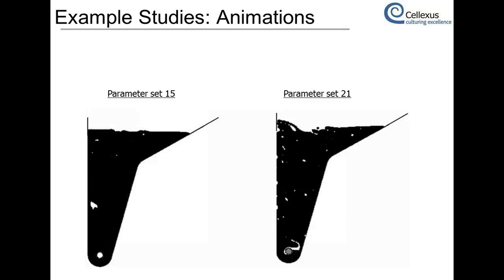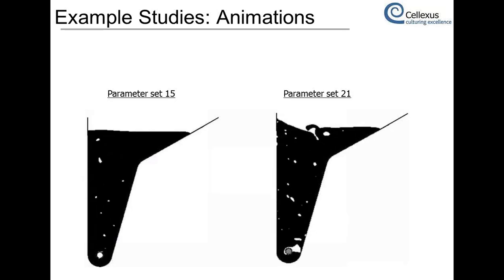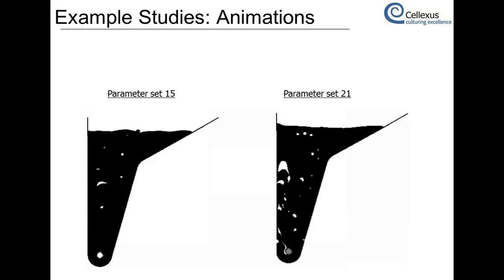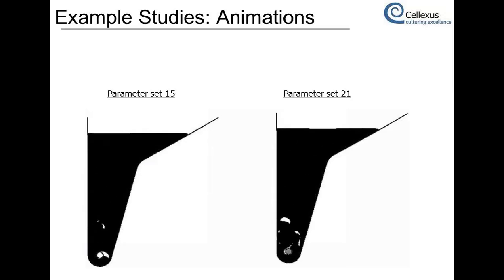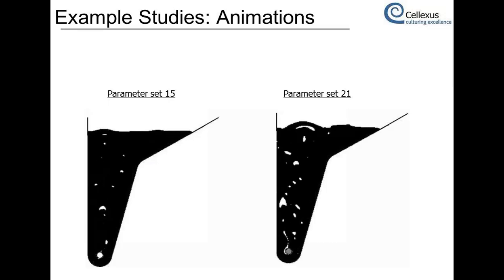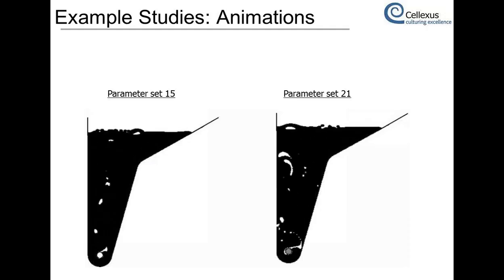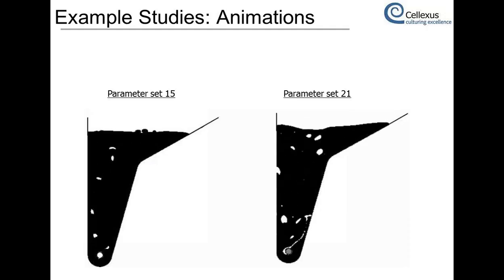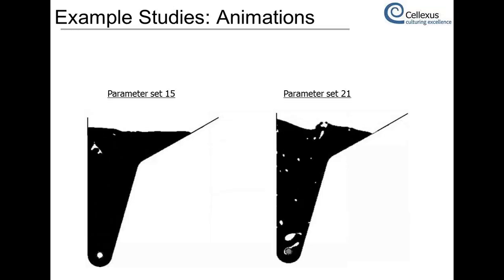As you all know, or I hope you all know, that finite element analysis or finite element models need to be validated against something. And this is the validation stage. Obviously, it's not always possible to do validation of the models, and sometimes you have to sort of use finite element analysis as a comparative study to find out which type of design is getting better or which is getting worse in certain types of parameters. But it won't give you absolute values. In this case, we validated the models.